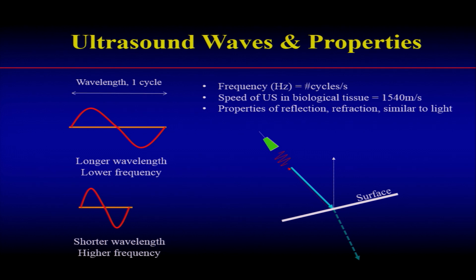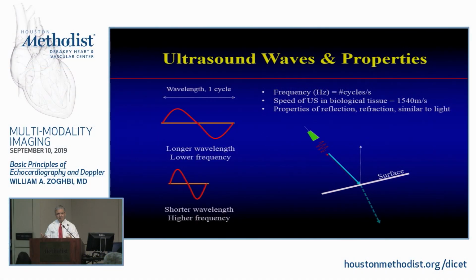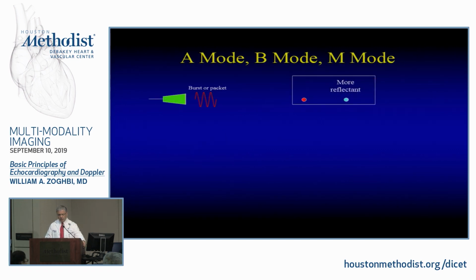So you could surmise already, how do I know the depth of certain structures? I solve the equation for how much time it took for the signal to come back, so I know what the depth is, right? So depth is not a scale of depth, it's solving the equation for whatever medium you're talking about, okay? So let's talk about also these bursts of ultrasound.